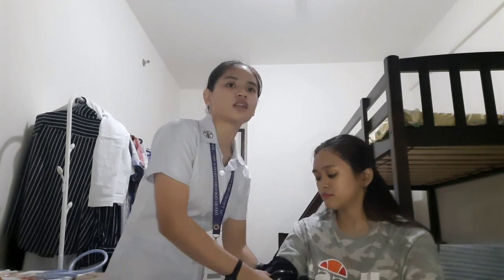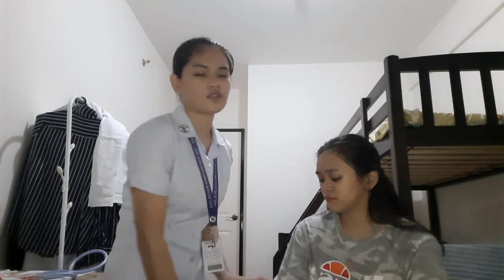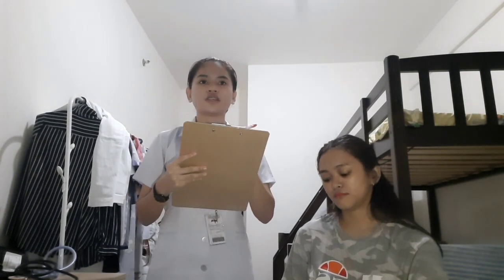So I have already obtained the final blood pressure, which is 120 over 80, which is normal. Next, I will remove the cuff from the client's arm. Then I will wipe the cuff with an approved disinfectant. I will document and report the pertinent assessment data according to the agency policy. This is to take note of the findings as a record.